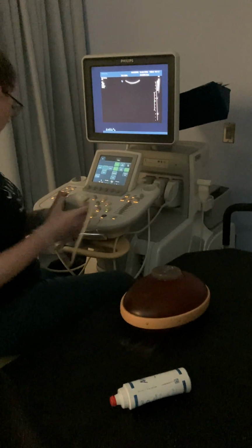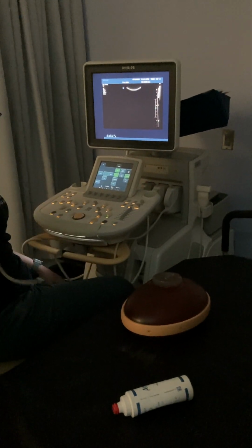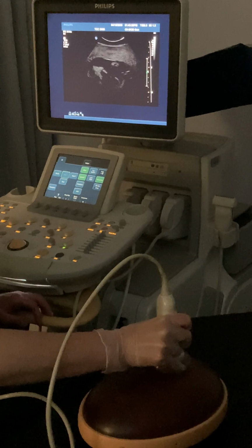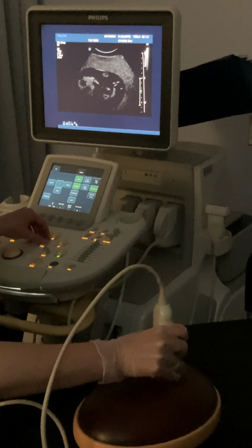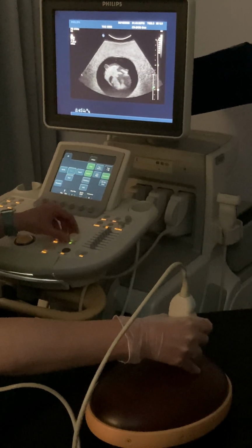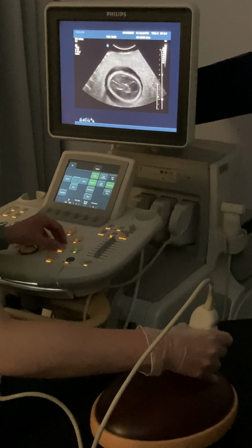Biometry, what are we looking to measure for biometry? You guys know? Yes. BPD, head circumference, abdominal circumference, femur, yeah? Yes. Cool. So here we are up at the head.